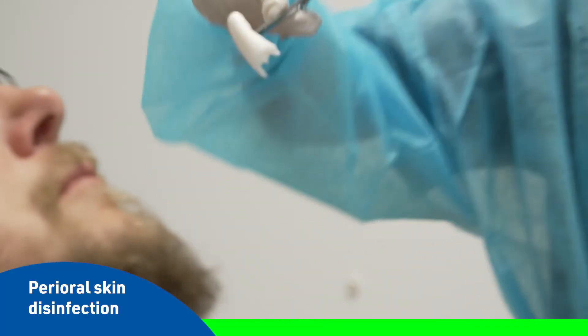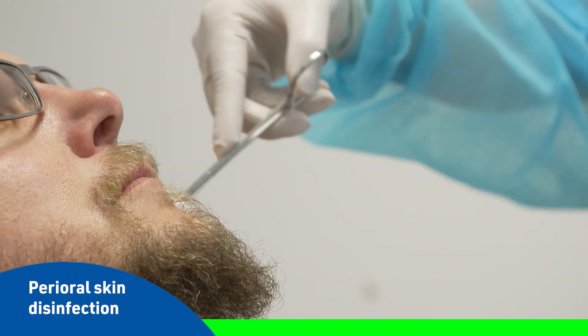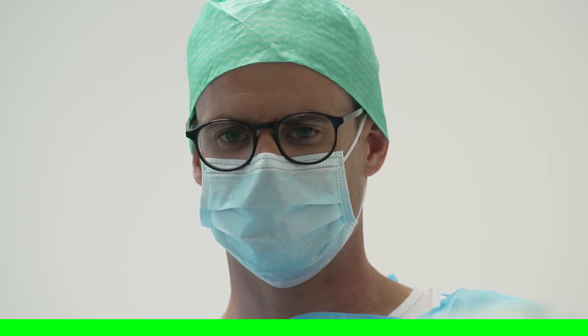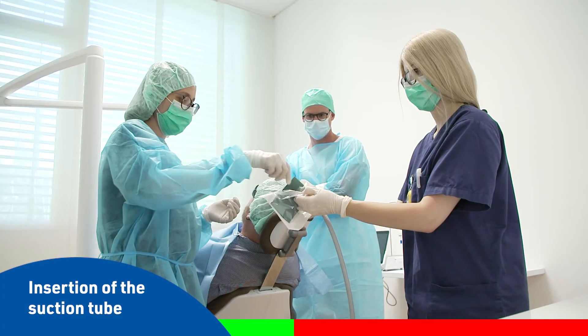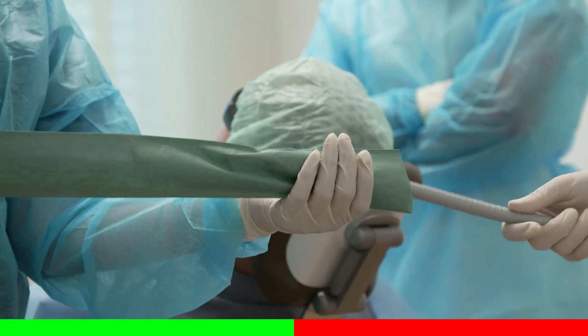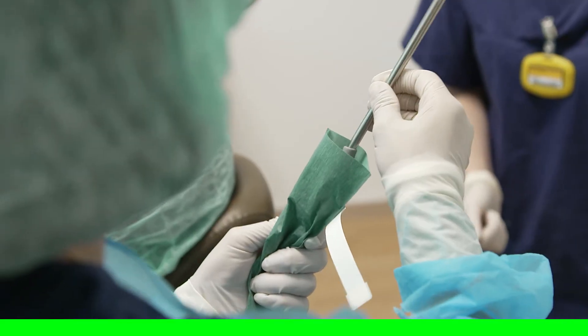The skin around the mouth and nose are disinfected, and the patient is covered with a sterile drape. The suction tube and cannula are then inserted.